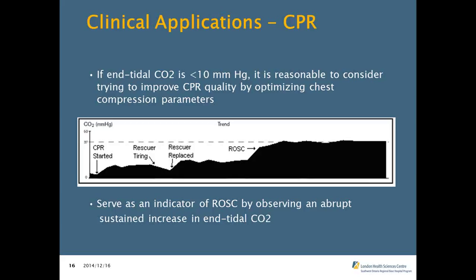Again, just a piece of the puzzle. You're going to be looking at other factors as well when it comes to ROSC. So this doesn't actually change the care of our patient. As Matt said, it's a piece of the puzzle. So for example, if we saw a prolonged, sustained increase in the end-tidal CO2 and we're seeing some electrical activity occur on our cardiac monitor, we may anticipate that we could palpate a pulse, for example. Absolutely. And again, all these studies have been done in intubated patients, so there's no evidence out there whether or not the same holds true with just BVM or using a King LT.